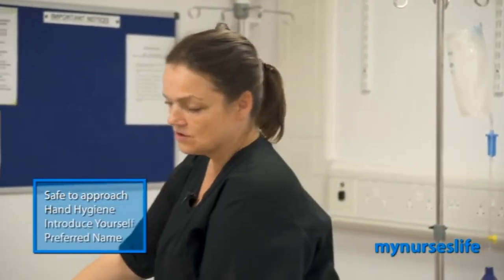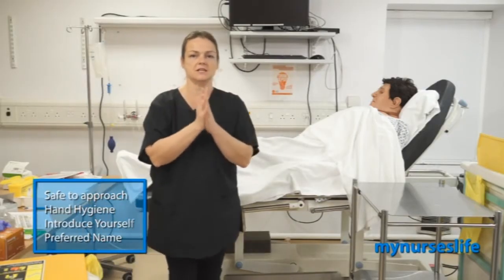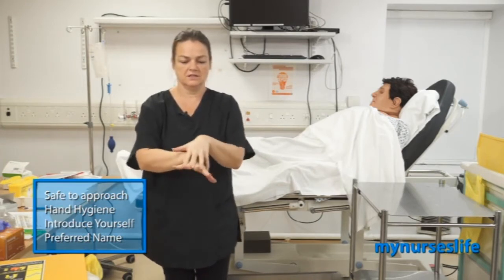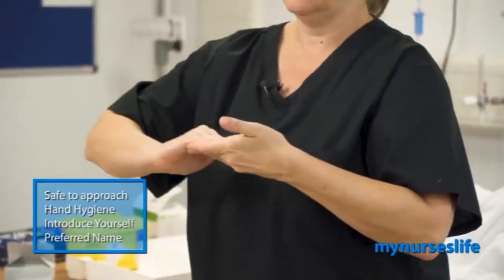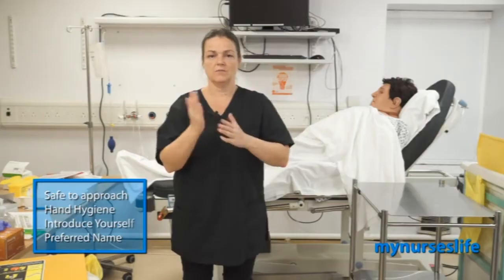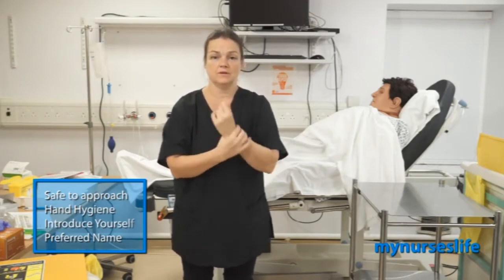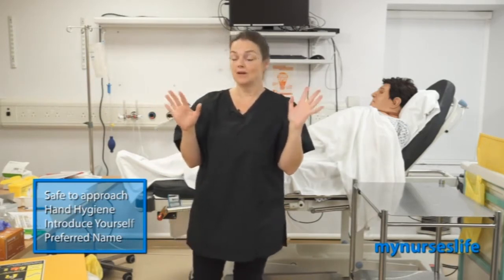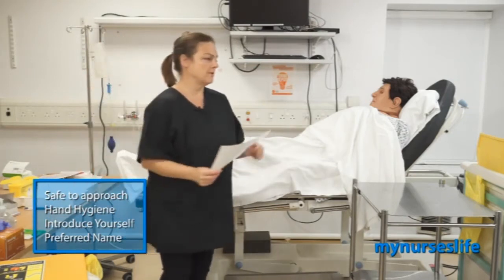There's no obstacles or anything to slip on, and I'm going to do 7 steps of hand hygiene. You can verbalise this or not, it's just important that you do every step. And you take 30 seconds to do it and verbalise 30 seconds to dry. So I'm going to go and introduce myself.